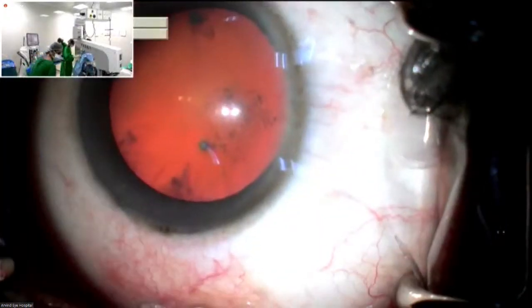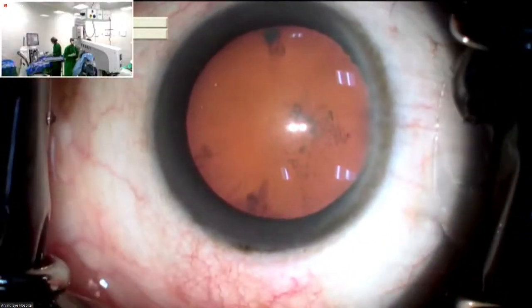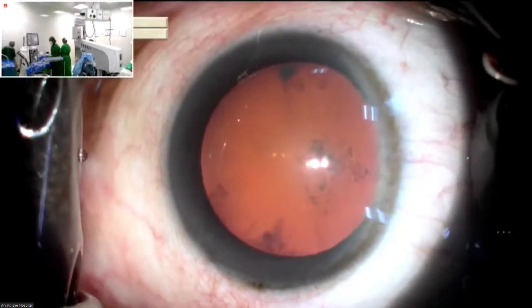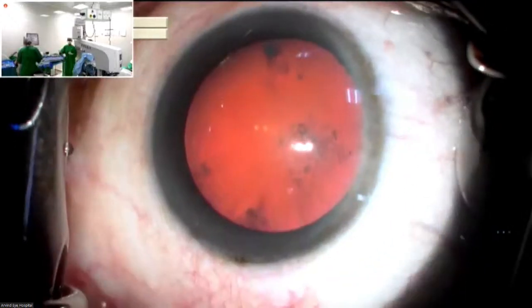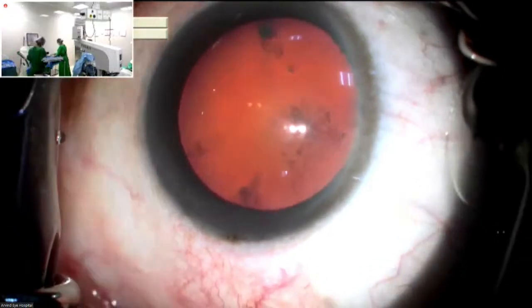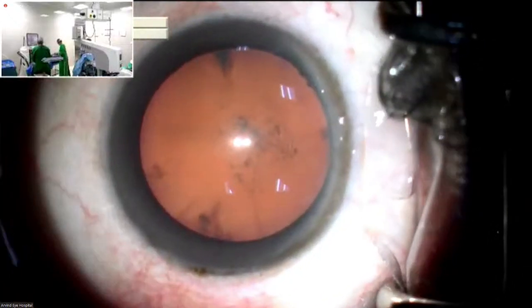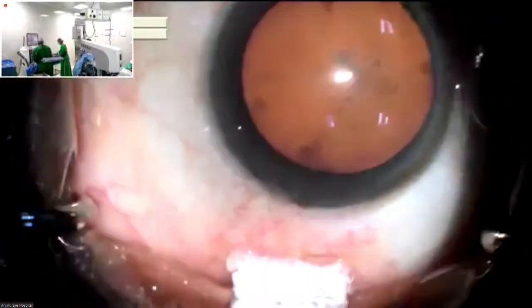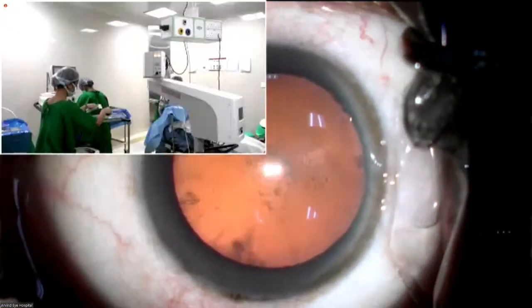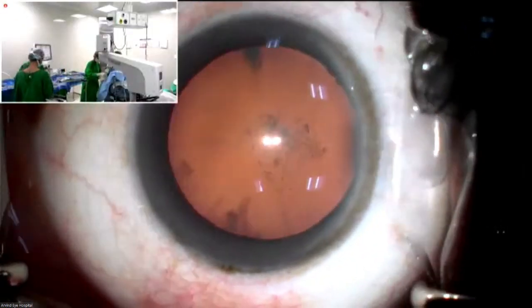So I'll be starting the surgery. Can we have just a little bit about patient details? Yes, please. Can the slide be shown? Is this case 1? This is case 1, yes. Haripriya has mailed the slides. Posterior subcapsular cataract with cortical cataract, visual acuity 3/60, axial length 26.97, K1 41.9 and K2 48.6, and intraocular lens power is plus 5.5 diopters. So it's a case of cataract with high myopia.